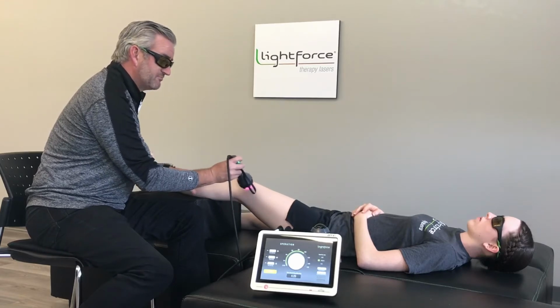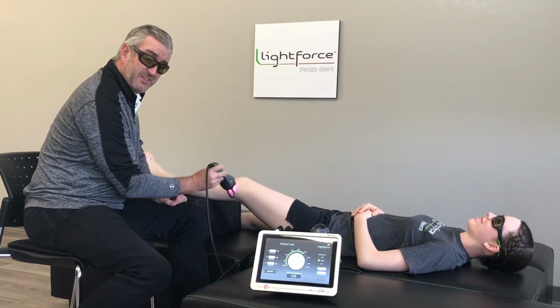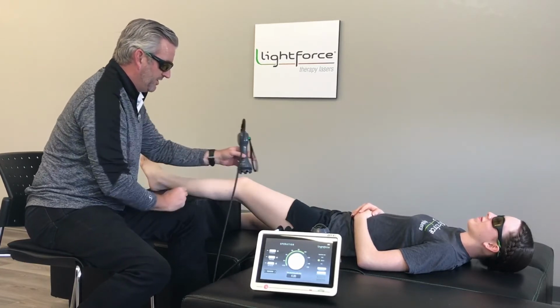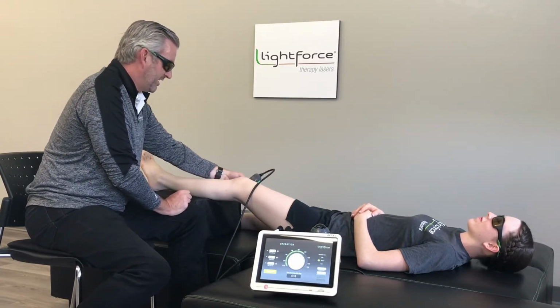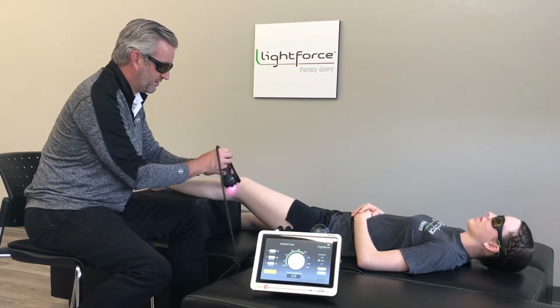How's that feeling? Feeling great. You want to make sure you're checking in with your patient every 10-15 seconds to make sure the temperature of the laser is okay. While you're treating, it's important not to stop that motion and keep it moving at a nice constant pace as you're going around the joint.